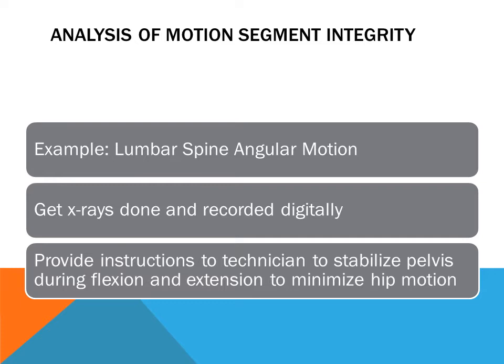If at any time you are dissatisfied with the quality of images that you get from your local imaging facility, insist that the injured worker be brought back and that the images be taken better, whether that requires different factors or different patient positioning, whatever. But you are responsible for ensuring the quality of the images.